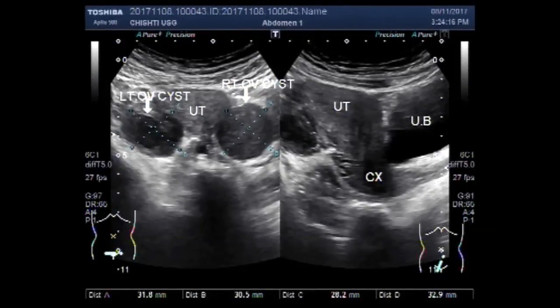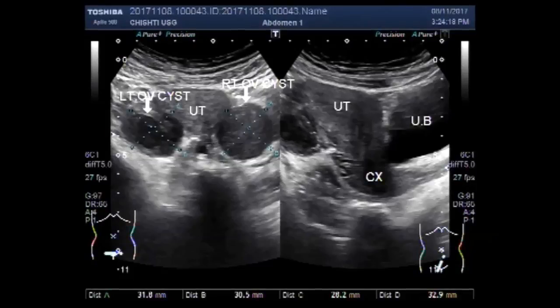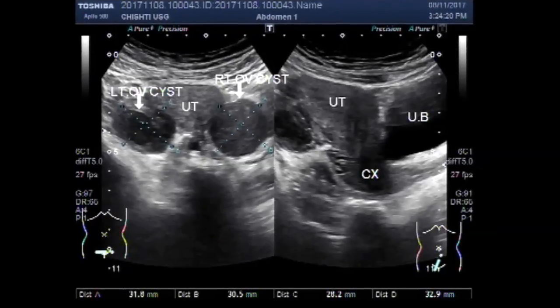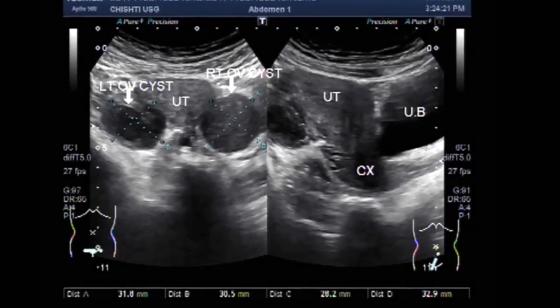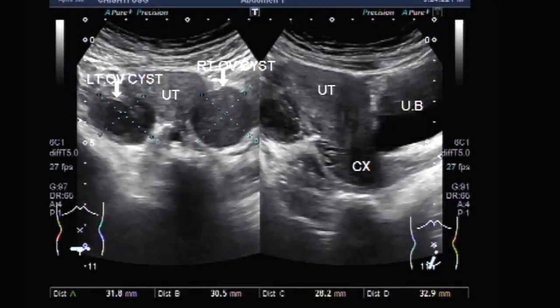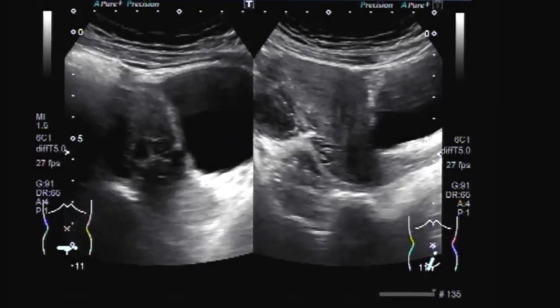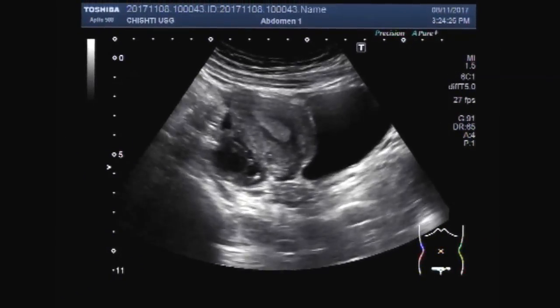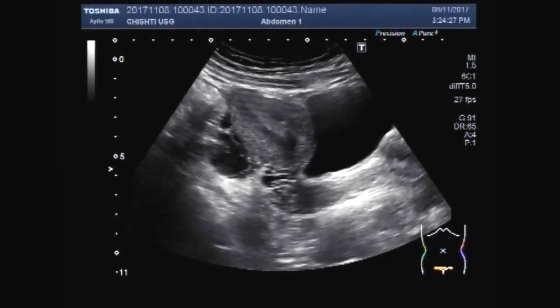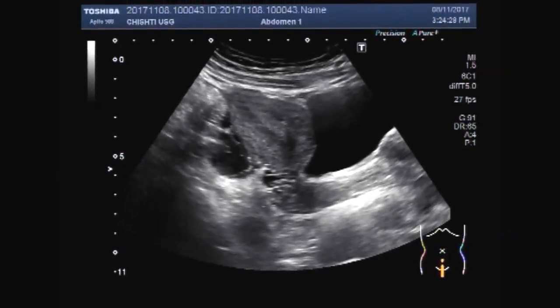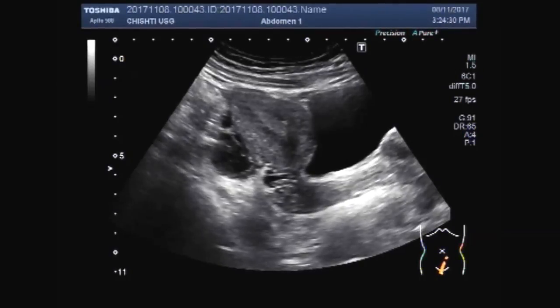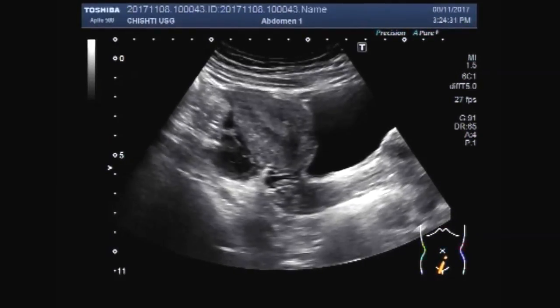Hello viewers, I hope you are all fine. In this video you can see a female patient having ovarian cysts on both sides. Both ovaries have a cyst in their interior.